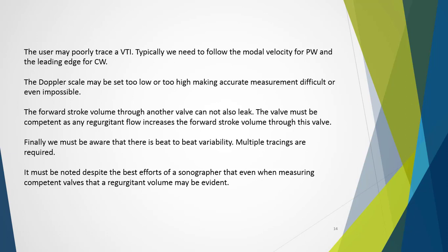It must be noted, despite the best efforts of a sonographer, that even when measuring competent valves, so both points that didn't leak, a regurgitant volume may be evident. The grading of severity that we have are set with standard deviations of 95% confidence, so we minimize the possibility of a normal valve being classified as having anything more than mild regurgitation.